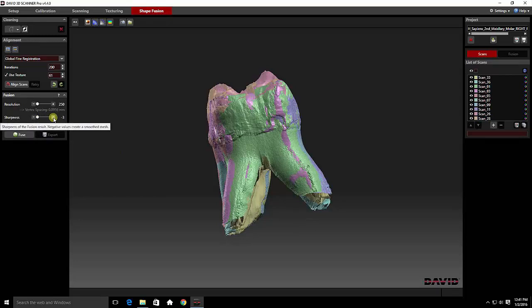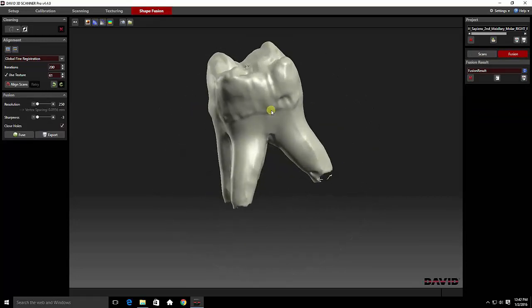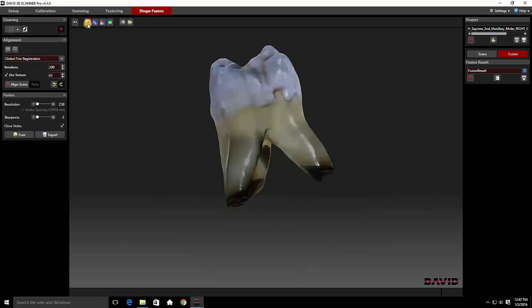So this setting you play with. The resolution effectively determines the size of your file and the clarity of the picture. If you're dealing with an object that has a lot of subtle features, you will need to save at higher resolutions to preserve all that photographic quality. But you can save multiple images — you can click fuse and export several times. We'll start with the lowest settings. Now we have our fused model of our tooth. These are some of what I call the little floaties — parts of the scan that didn't quite become incorporated into the whole. Now let's see how it looks as a photograph. And that's our model.